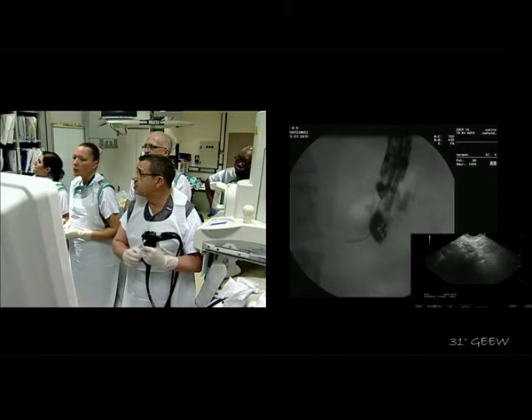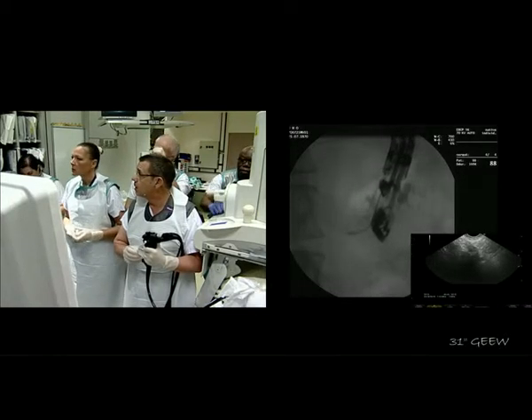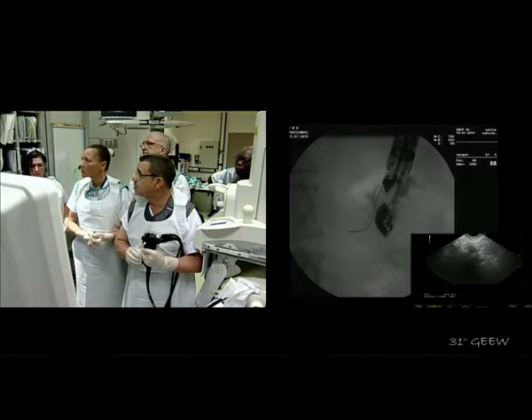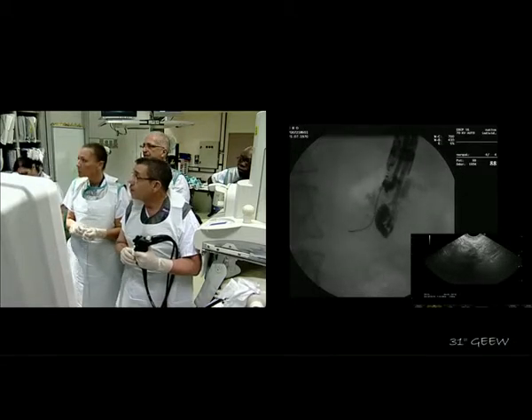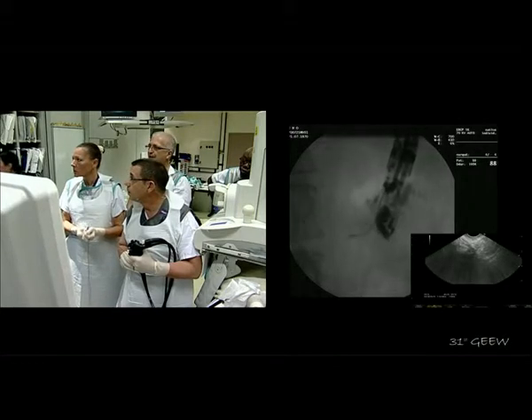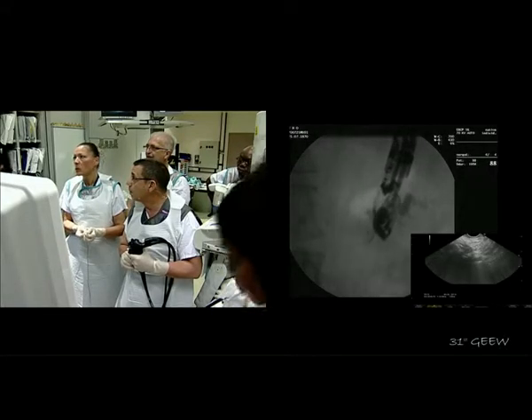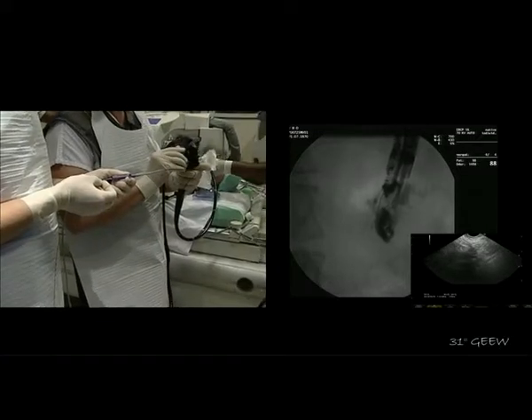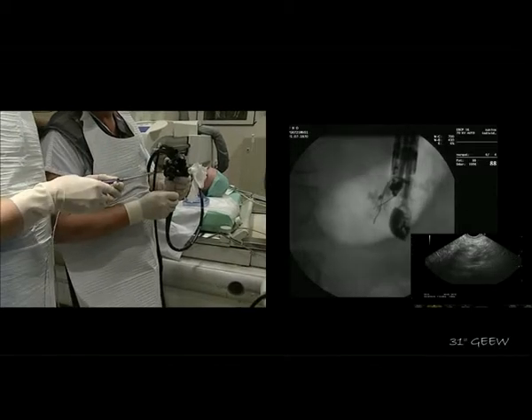Okay, now I use the 6 French cystostome, which is the cystostome from Endoflex. Okay, you see the cystostome arrive now. Okay. So a very important point here is to avoid being too curious endoscopically. When you do this kind of thing, you have to keep the endoscope in the same position. Maybe pure cut 100. It's autocut effect 5. Effect 5 autocut.